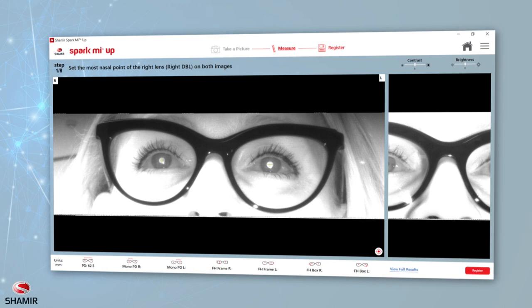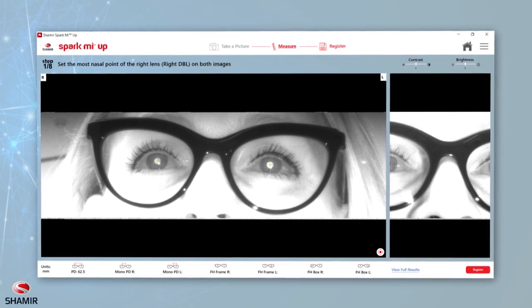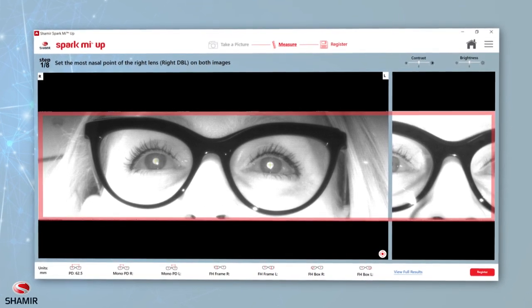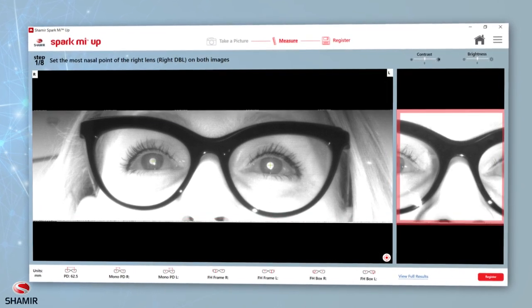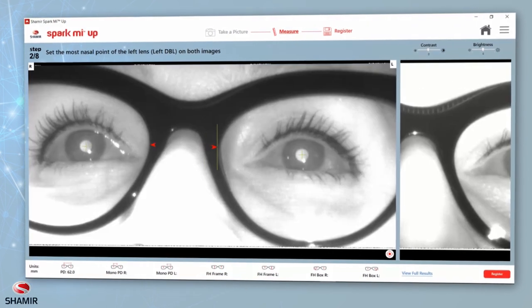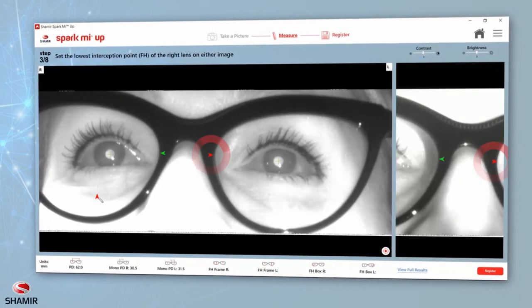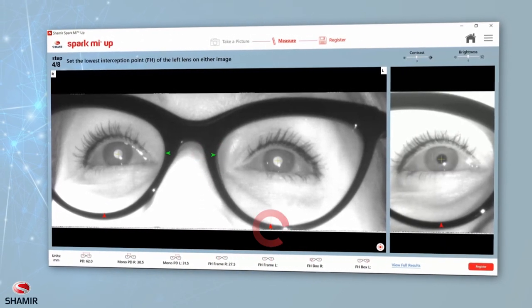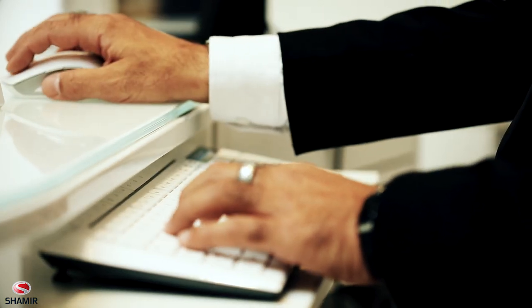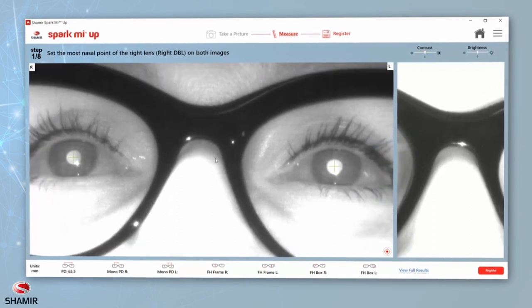Make sure the pupils were detected properly before beginning the measurements. If not, retake the picture. You are now ready to take the patient's measurements. The measurement screen displays two images of your patient: a primary image on the left and a secondary image on the right. During the measurement process, you'll need to mark eight points. Some of those points need to be marked on both images, and some only on one image. You can use the mouse scroller to zoom in and out of the images at any point in the measurement process.